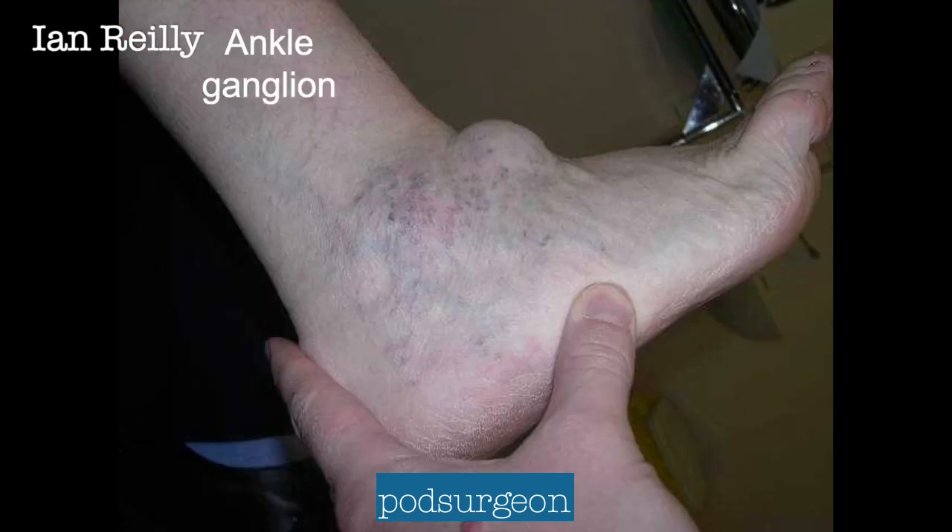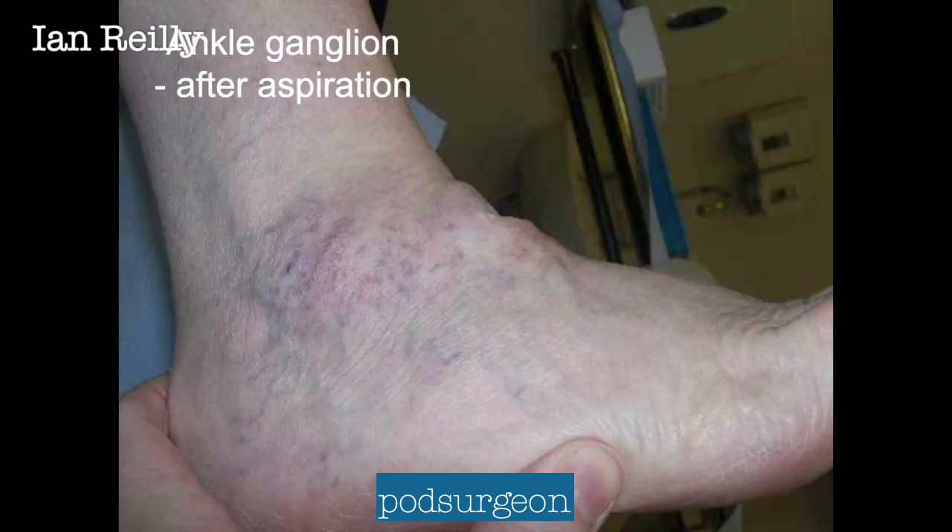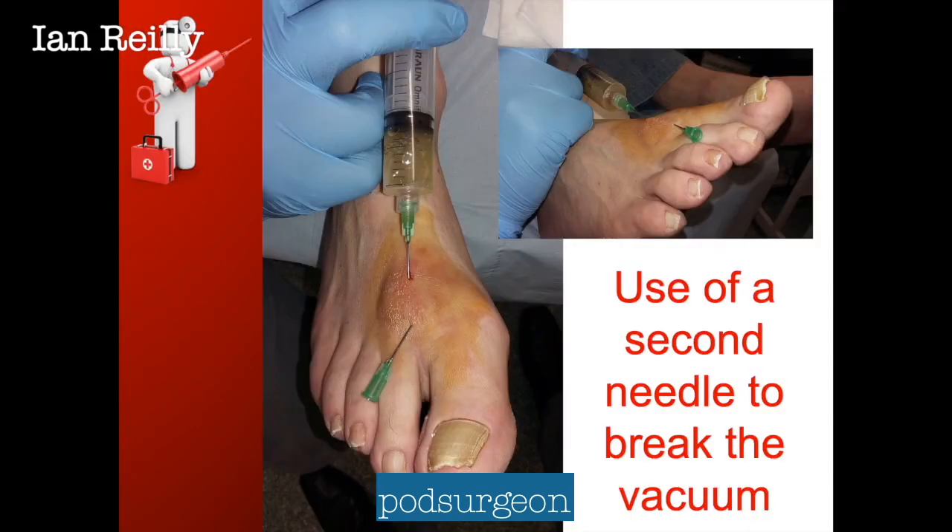Here's one of my pre and post images — a nice big ankle ganglion pre-aspiration and then post-aspiration. A little trick: if you put a needle in and you can't draw any fluid off, sometimes there's a vacuum. Breaking the seal with a second needle can sometimes make aspiration that little bit easier.